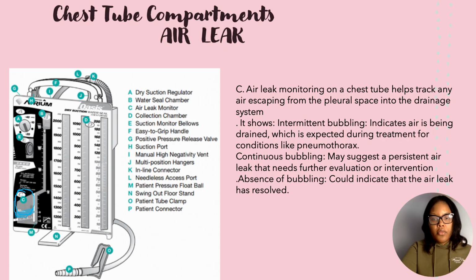Now, when it comes to your air leak monitor, if you look on here, there are numbers and little dashes. It lets you know, I believe it starts at 0 and goes to 1 to 5. So the greater the number, the bigger the air leak. In our water seal chamber, we have an air leak monitor.